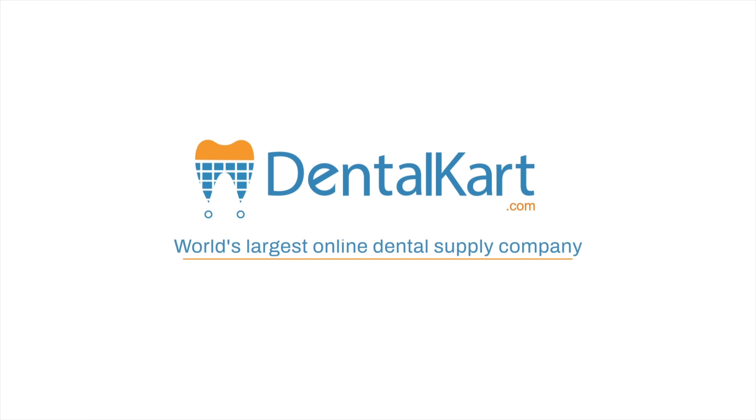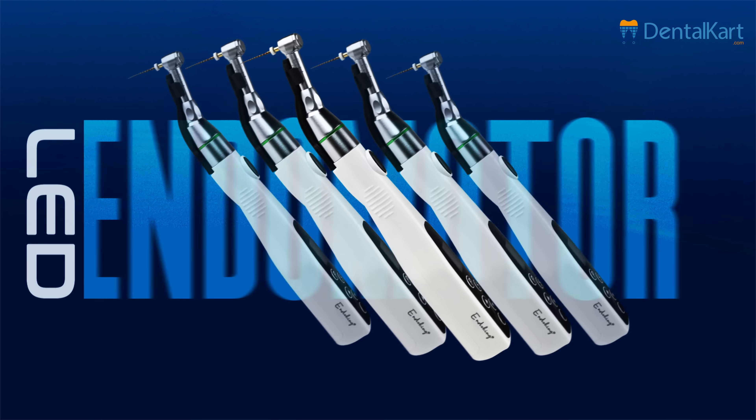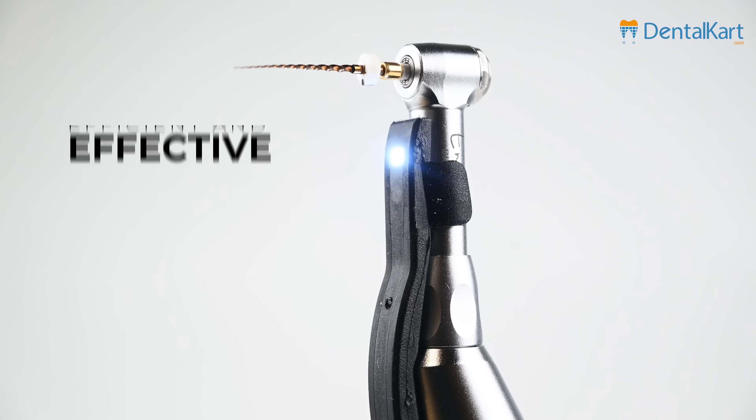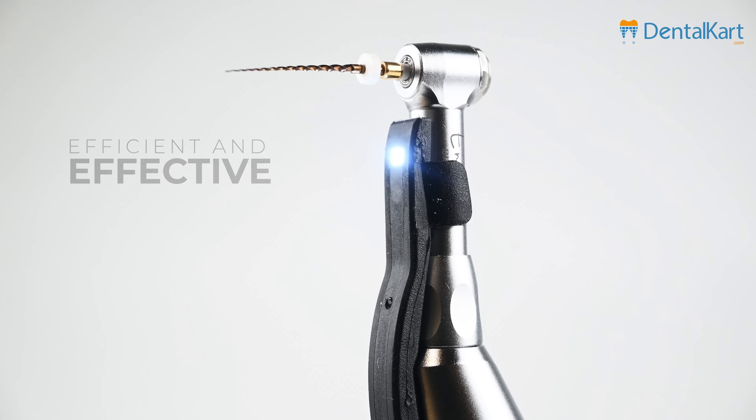Hello everyone, today we are going to discuss the Endoking Cordless LED Endomotor, a remarkable innovation designed to revolutionize conventional endodontics, making it more efficient and effective than ever before.